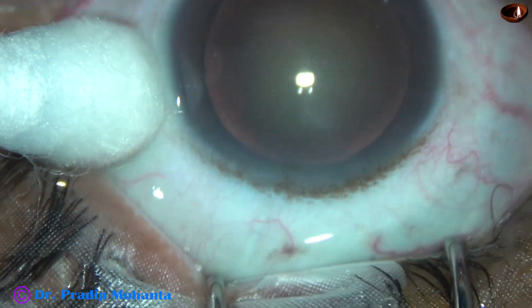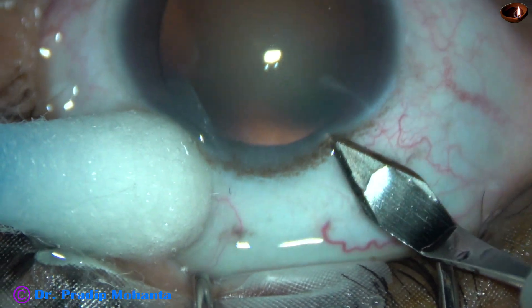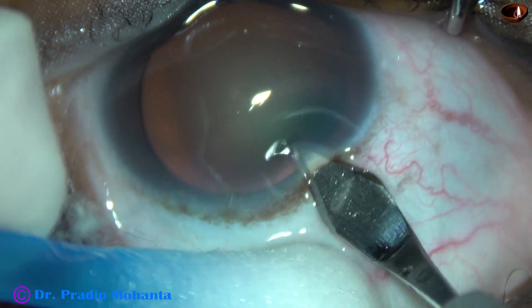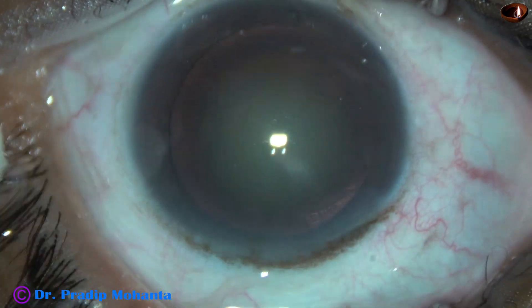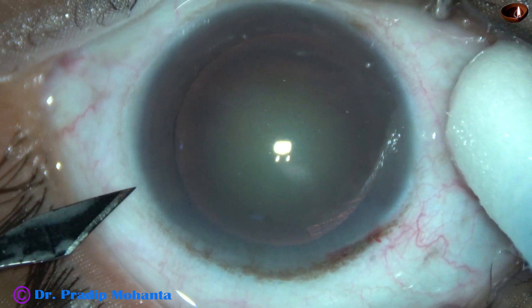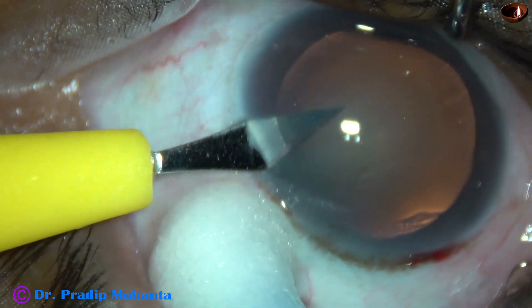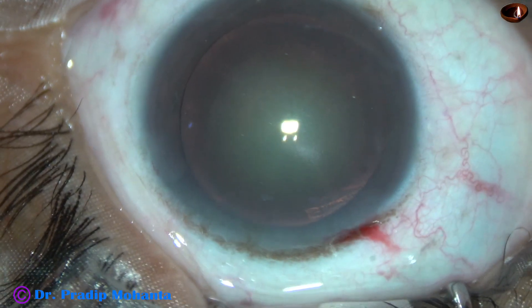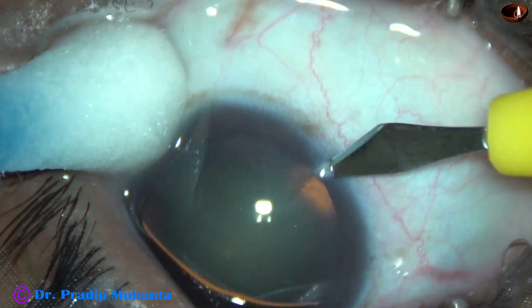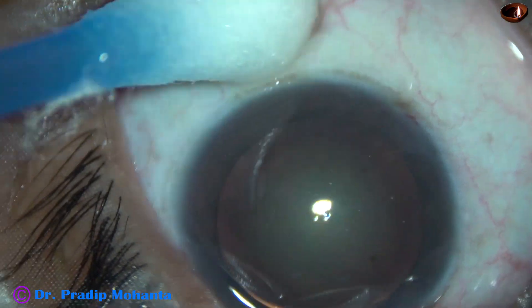This is the main incision with a 2.8 mm steel keratome on the posterior aspect of the limbus. The incision is at around 11 o'clock. This is a side port 3 o'clock hours away from the main incision on the left side. This is another side port the same distance away from the main incision on the right side.